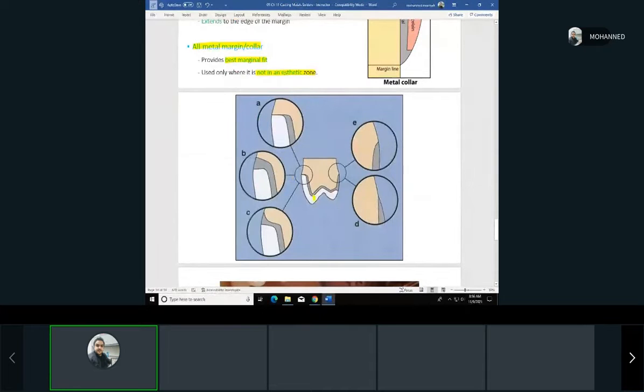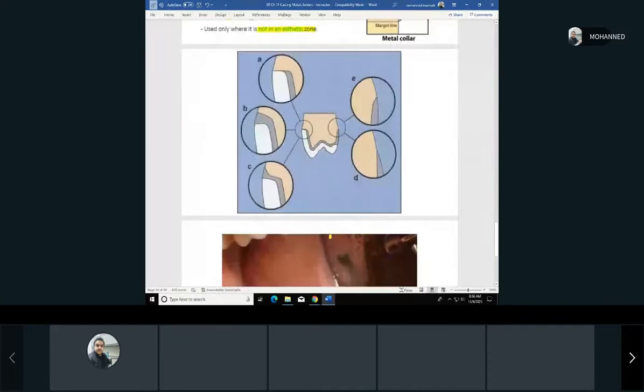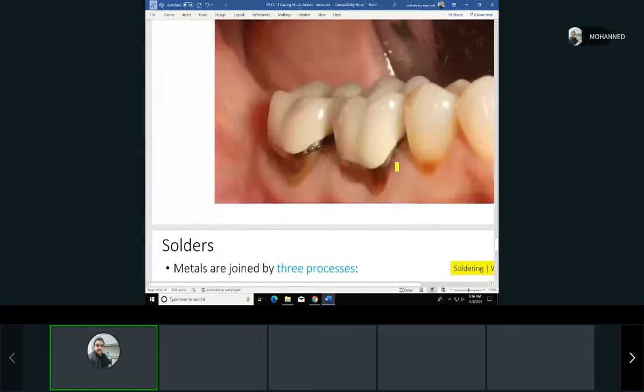So this is the tooth, this is the porcelain fused to metal crown. We can make it either all porcelain, or all metal finishing on here, or maybe a metal and some porcelain. Yeah, this is the picture I was looking for. So you can see here how the metal part is showing out of the tooth. This is a non-aesthetic area, so we can still make that, because nobody is going to see it if you don't smile too wide. But again, it is a better fit.